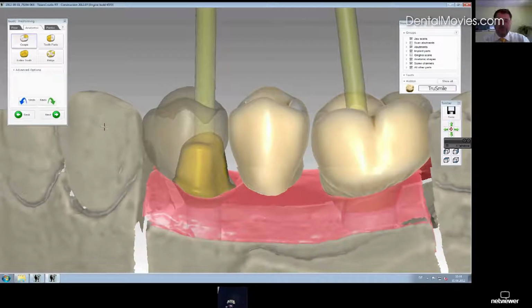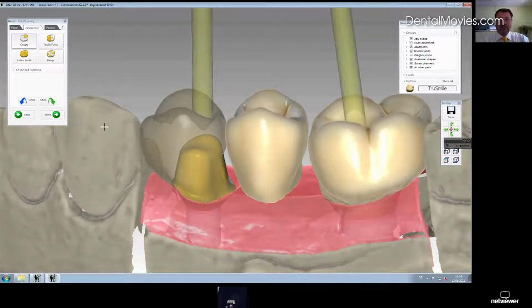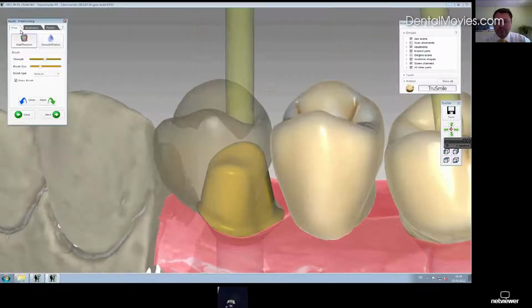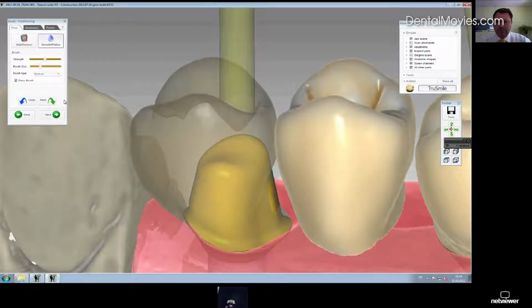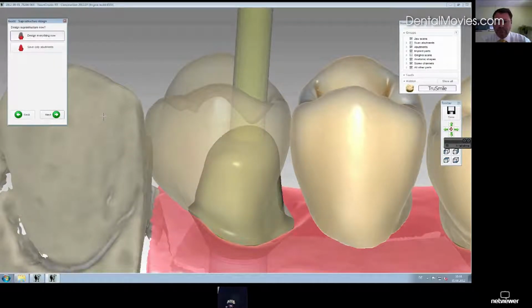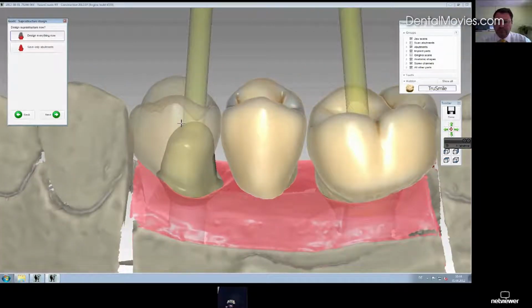And in this step you can design the bottoms again. Now here you can freeform it, or maybe smooth it a bit, or put material on it.